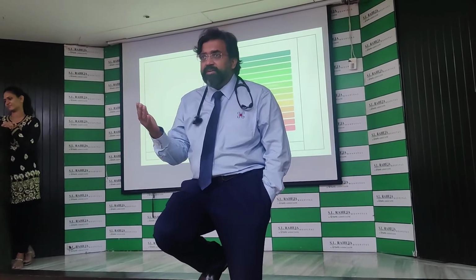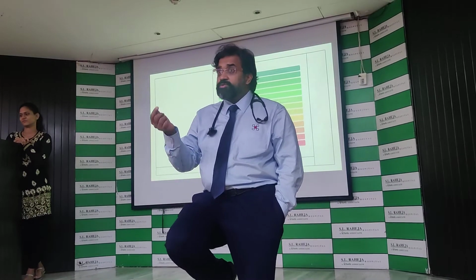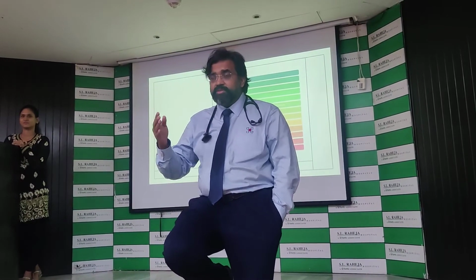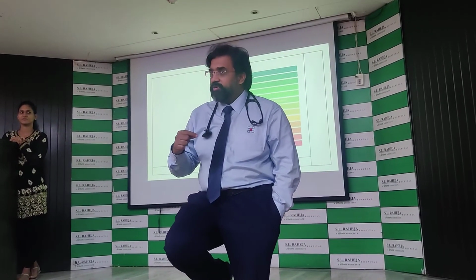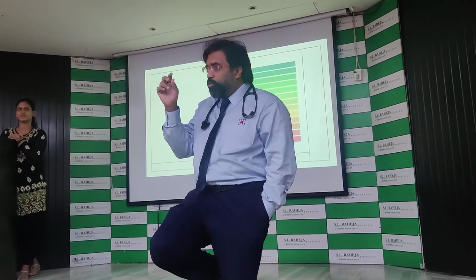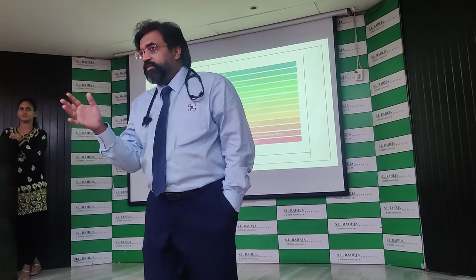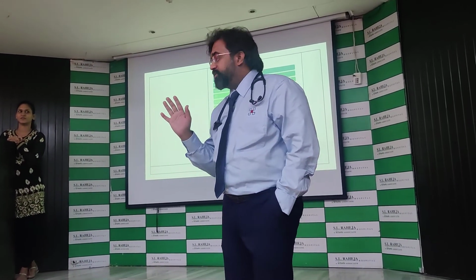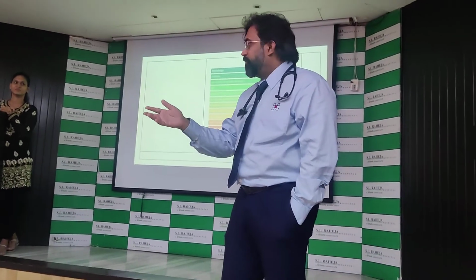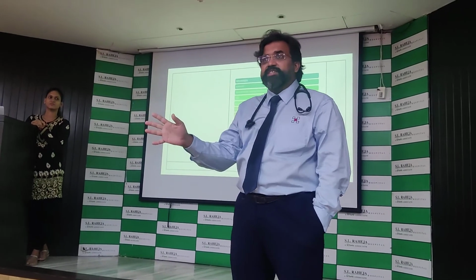So at the end of the day, when we monitor esophageal pressures in our ICU, we use an esophageal catheter. We get a waveform. This ventilator, when you attach that also, becomes a complete set. You get even the pressures. The only thing that you will not get, and you'll have to estimate objectively, is the regional overdistension. You have to think that the compliance is going down, so this might be overdistension, which in addition to this ventilator will make it a complete set.